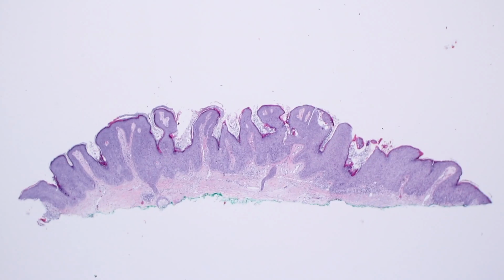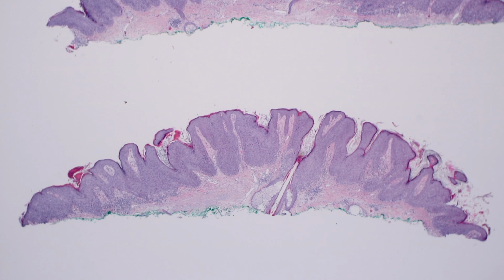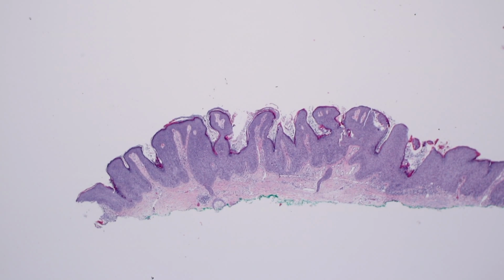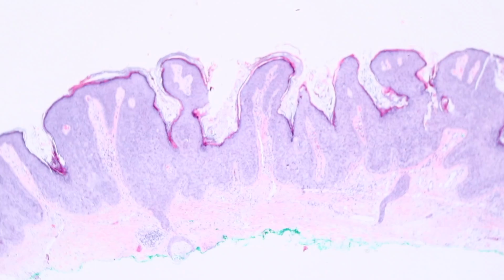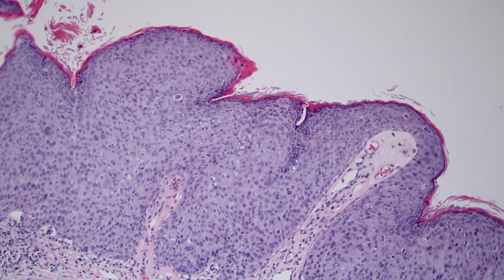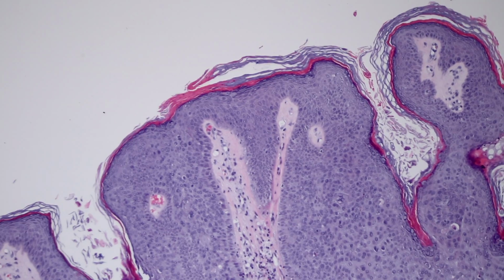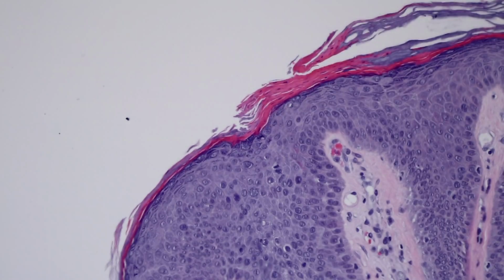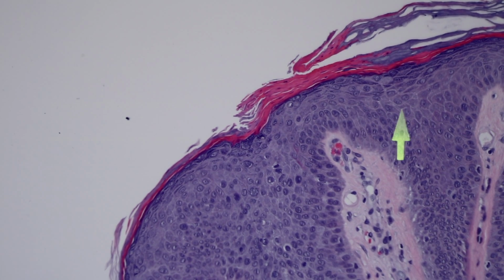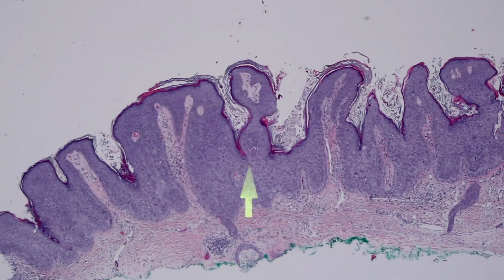And here's another one that is more obviously full thickness atypia, I think. Well, it will be in a second. But the reason I'm showing you from low power here, I want you to see it's got kind of that knuckled look like you would see in a condyloma. But again, this was not from the anogenital region. It was on the forehead of an older person. And there's clearly full thickness atypia here. But it has kind of, again, an HPV condyloma sort of appearance to it, or shape. And there again, some pagetoid up here that can help you as a clue to see these atypical guys that are kind of spreading up. And some of these really do look, to me, subtle, but kind of remind me of koilocytes a bit. So we do see that sometimes.